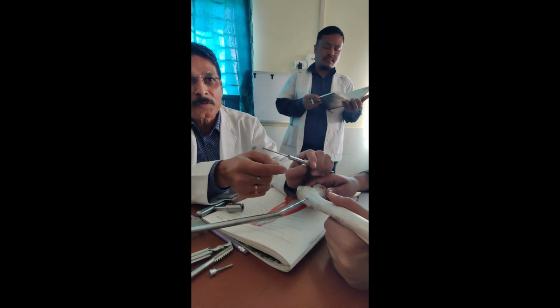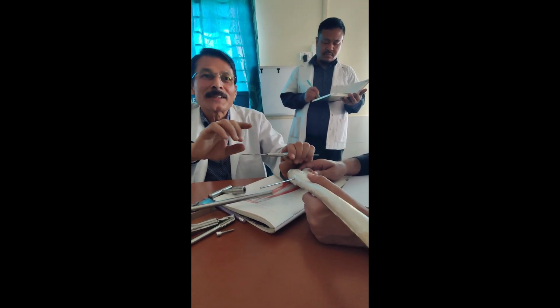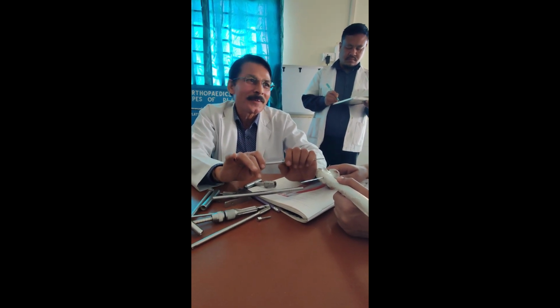Otherwise you try it, it seems to be going, but it is not going. Actually the whole fragment is rotating along with the screw. The rotation of the proximal fragment along with this screw means displacement, basically displacement. So you are losing the reduction. This is a simple thing, but it can make the final reduction unsatisfactory.